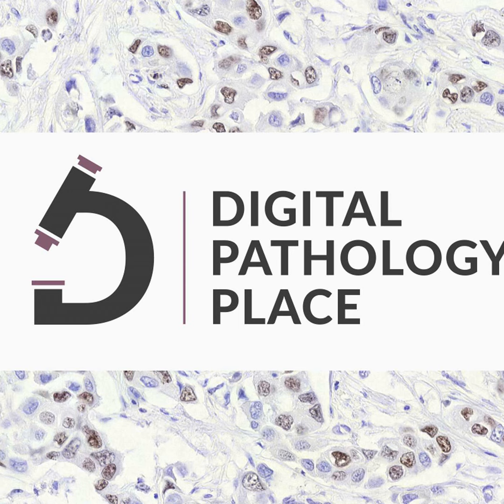So anyway, in each of these options, you skip some of the analog steps of digital pathology. You go direct to digital, and that's a huge advantage, because radiology and all the other digital imaging have it. They don't have to go to analog and then to digital like pathology. And I'm like, okay, until that goes away, we're not going to be as good as the other ones, but we are as good as the other ones, but just have glass slides. Okay.